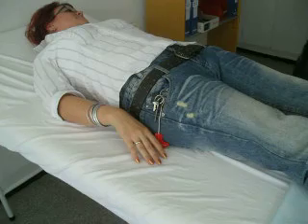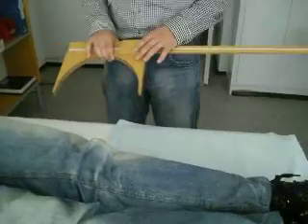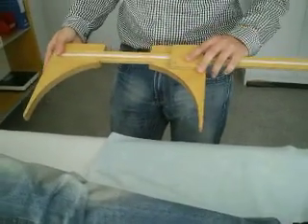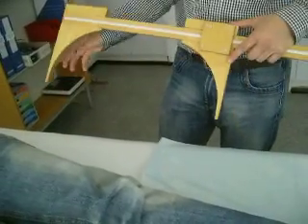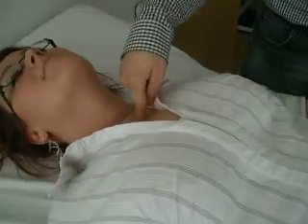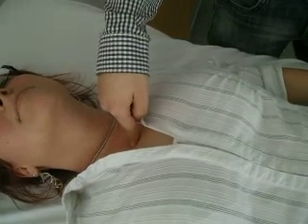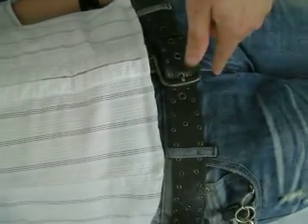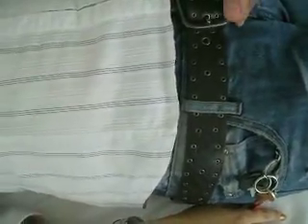For that, either you use the standard tape measure, or it's better to have a so-called caliper. This is not the standard that we supply with the set. Standard, we just supply a simple tape measure. Now the distance that I would like to measure is from the jugulum, which is the suprasternal notch, to the pubic bone, which is right here. You have to palpate it. So this is the upper edge of the pubic bone. Okay, and this is the distance that we are interested in.